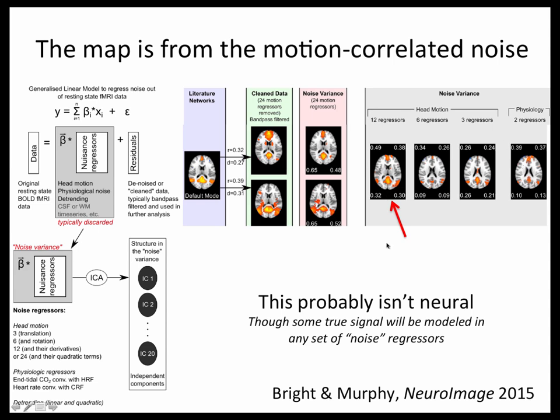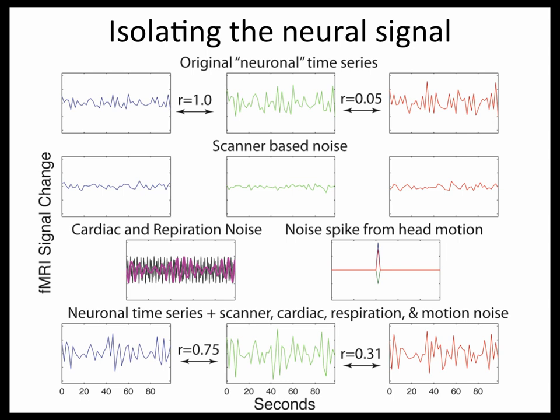But it just gives you a word of warning, both about being confident about these findings, and also about ICA. Because what it says is ICA is not really a value judgment. It's just a mathematical equation, and it's going to find things like this in the math no matter what. And that doesn't mean it's bad. It just means you have to be cautious.